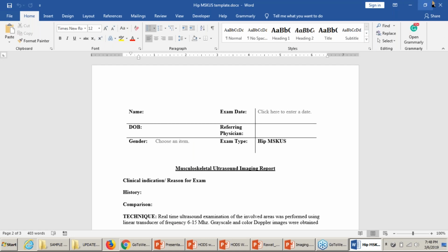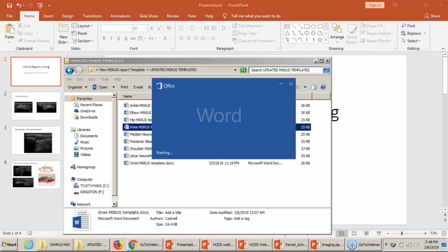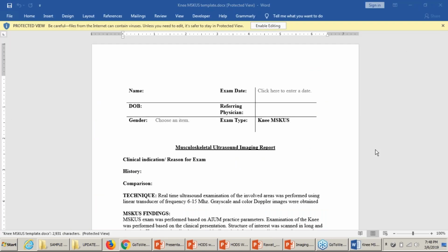So now after hip, let's go to knee, and then I'll show you ankle. And you can ask me any questions if you have. I can answer those right now if you want me to.